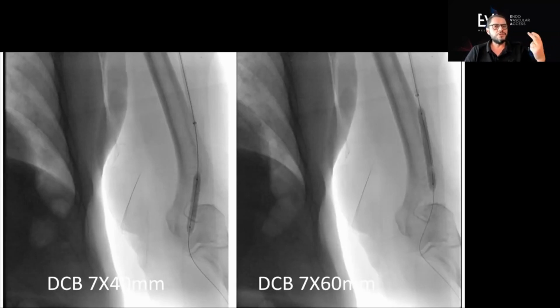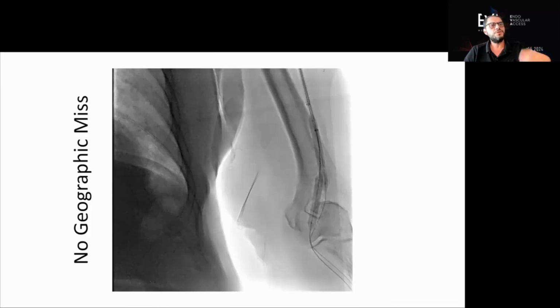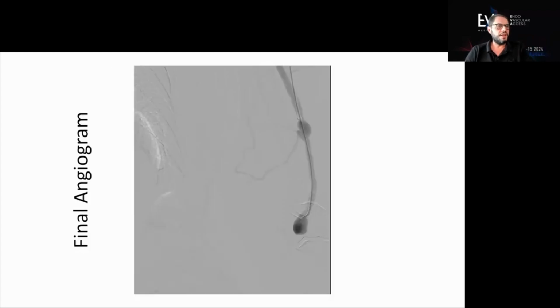In case you use two drug-coated balloons, you have to make sure, and you can see that in this overlay, that you cover the in-between segment enough so there is no geographic miss there as well. And this is the final outcome.